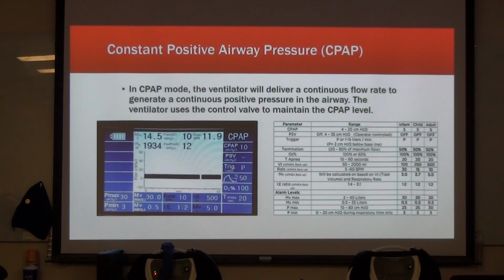You'll have hell remembering and finding all those numbers. Take a picture of my vent settings. I never think about pulling out my phone and taking pictures. Is that what you do? Yeah, you're definitely going to have it, because every one of those has a column in that thing. I'll definitely have in your report piece for you to provide mode, rate, volume, FiO2, and PEEP.